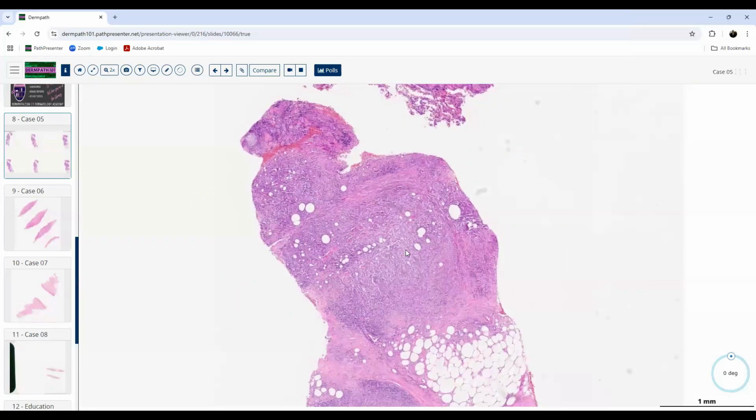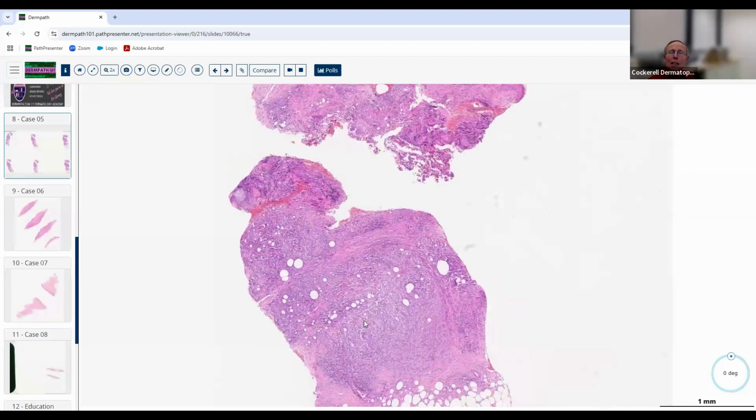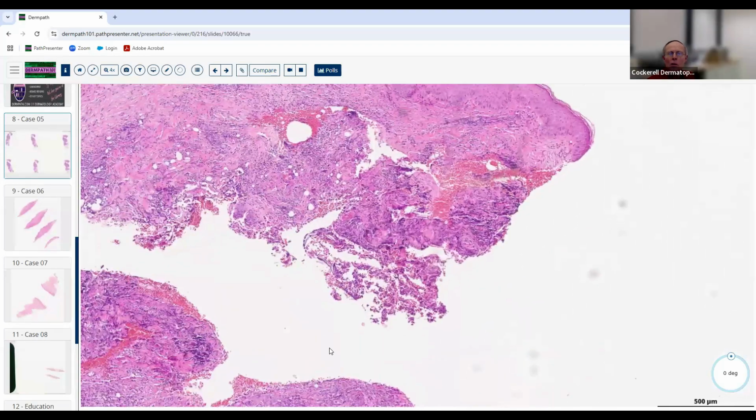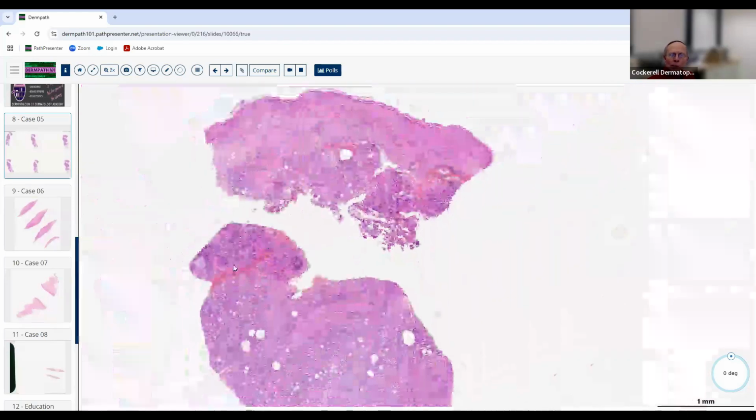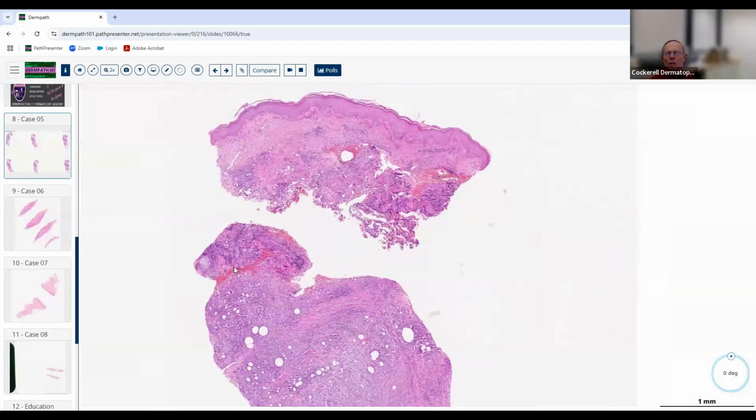It's really more suppurative and granulomatous because there are neutrophils up in this area for sure. So when we see suppurative granulomatous dermatitis, we think of infectious disease number one. We also think of foreign body, maybe secondary to a ruptured cyst or something like that. That can also give you suppurative granulomatous dermatitis, but we definitely want to think about an infection.